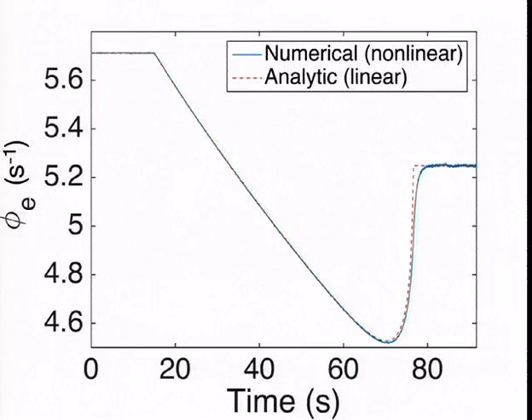And what we find is that provided that we change our connection strength slowly enough, the system continues to converge to that steady state. So it's a classic separation of timescales where we have our slow dynamics of the change in the steady state and our fast dynamics for the neuronal activity itself.